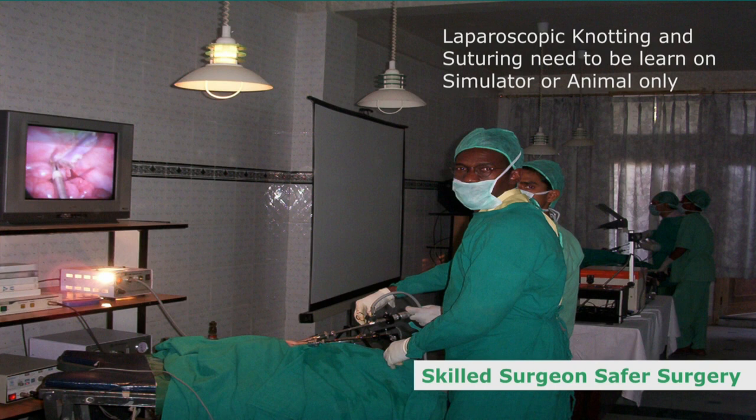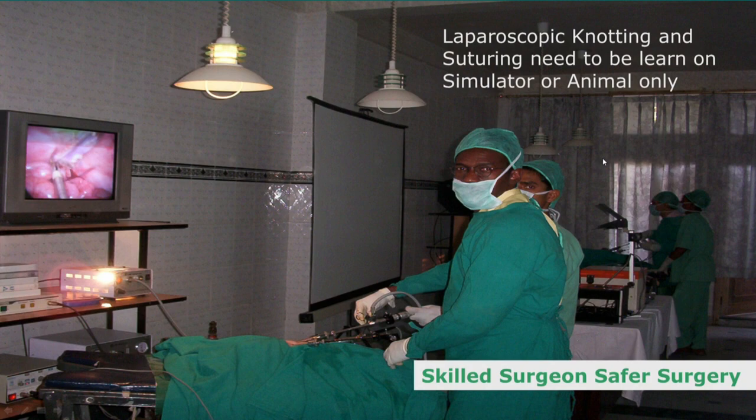That's why you should have an endo-trainer at home, put the suture in, and start knotting spontaneously to develop your skills. Many things cannot be described in a book or video — we will hold your hand and discuss those tricks with you during the suturing and knotting practice sessions, because every surgeon has their own problems that need to be carefully rectified.